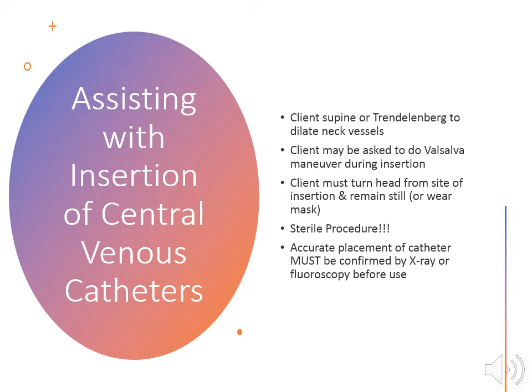When you're asked to teach somebody how to do the Valsalva maneuver, you want to instruct the client to take a deep breath, hold it, and bear down with their mouth closed. It's the same as straining to have a bowel movement.